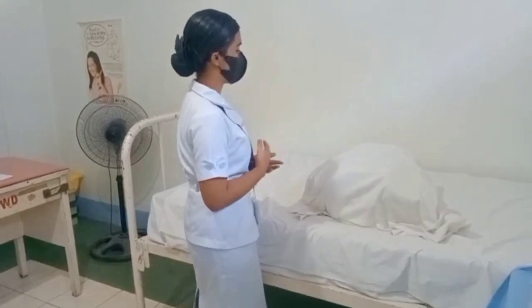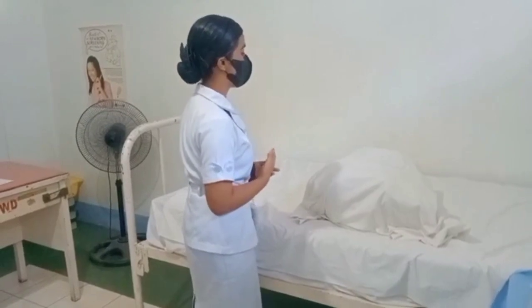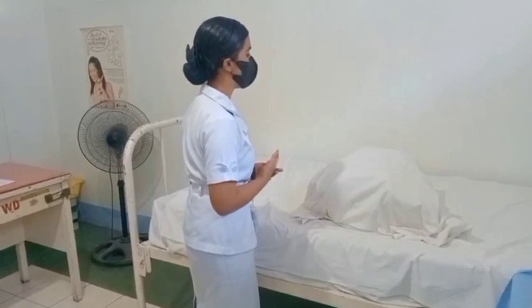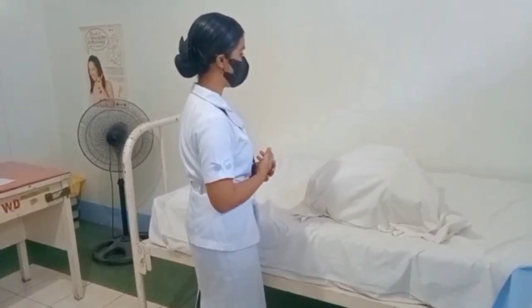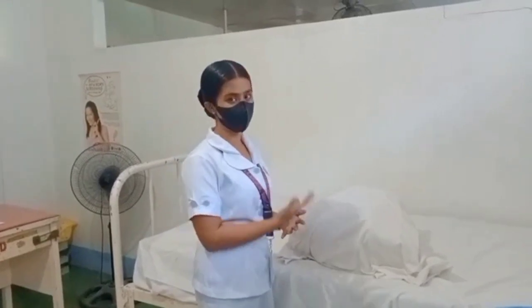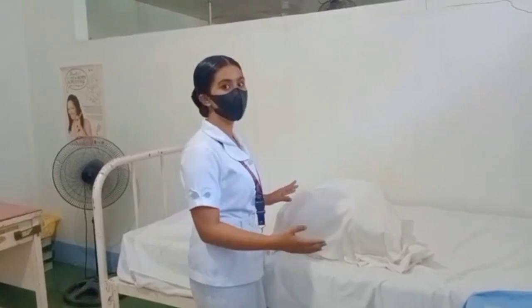A catheterization is the insertion of a catheter through the urethra into the bladder to drain urine or to instill medication or fluid. Is that okay with you, ma'am? So I will assess the client in an appropriate position. I will position the client in a dorsal recumbent.